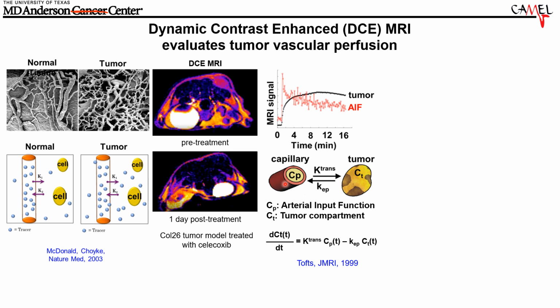And both of them can be informative for these types of studies. There's been a very active decades of research in this area to refine the pharmacokinetic models, take into account other assumptions and corrections. And to be honest, it still is a work in progress because the data from MRI is somewhat noisy and difficult to extract a lot of complicated information from this data because of the noise.